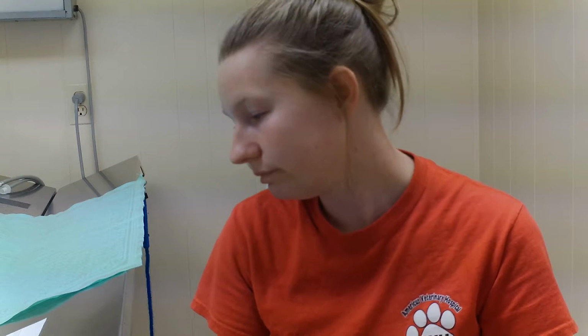Jaw tone. Jaw tone is a good indicator, definitely. I don't know how many times we have been trying to intubate a patient, and the jaw tone, somebody's premature, we're trying to intubate, and the assistant will lift the dog's mouth up. The doctor will go in to open the dog's mouth, and the jaw tone is still very much present. And they go to open the mouth, and the dog either sneezes, or they just bite down harder, and the doctor now has a bit finger. How many times it has happened.